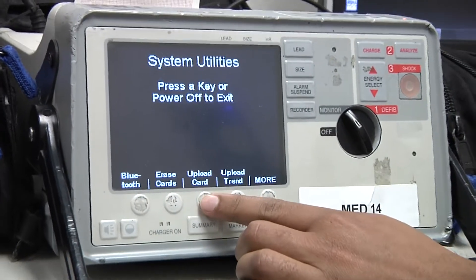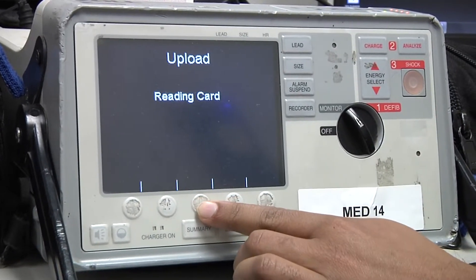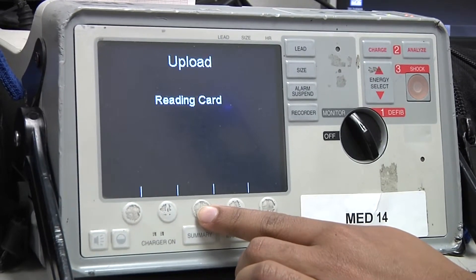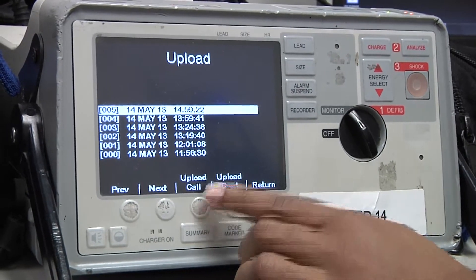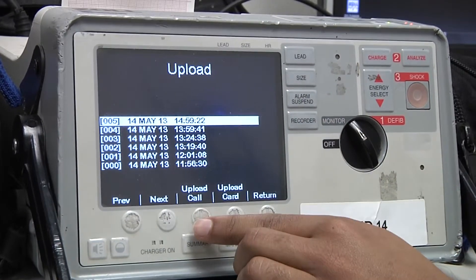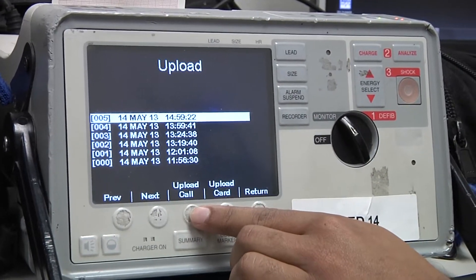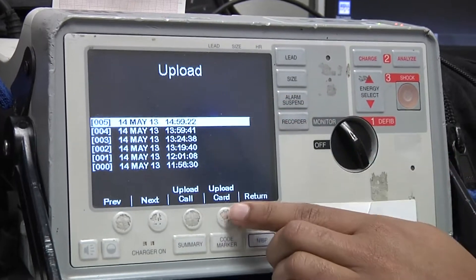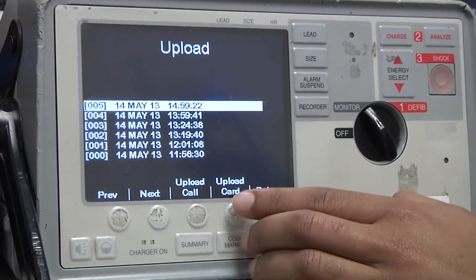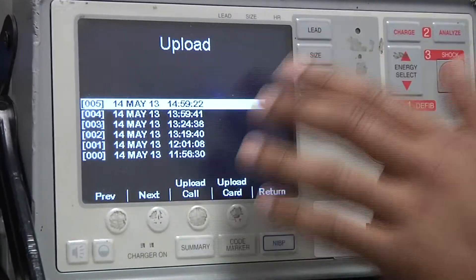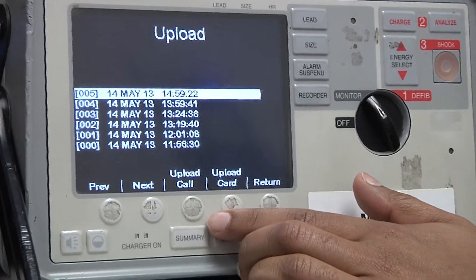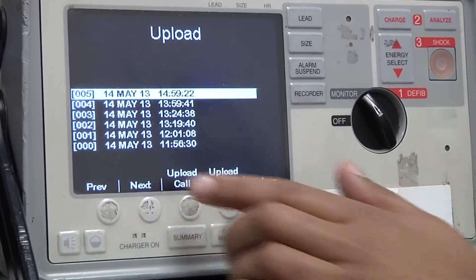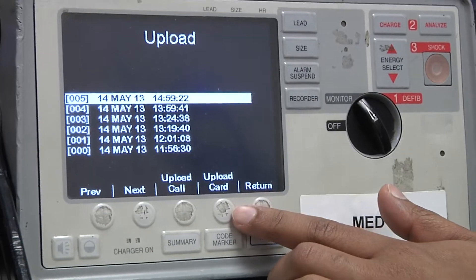Then I'm going to select upload card. It's going to say reading card, and then it's going to display every single case that's currently located on the card. Normally you would select upload card to upload everything at once, but for purposes of this video I'm only going to select one case so that it goes quickly.